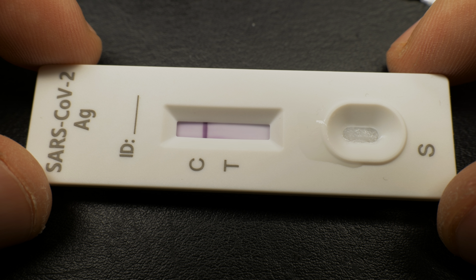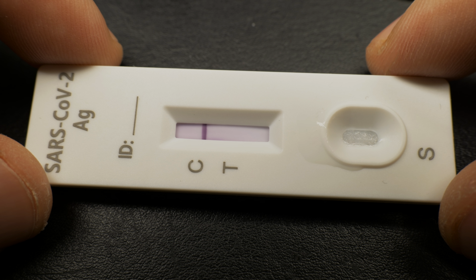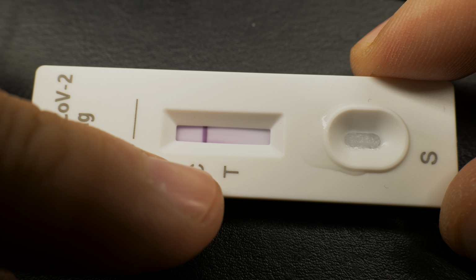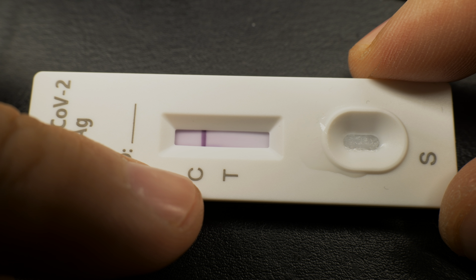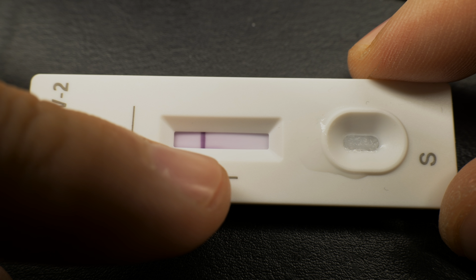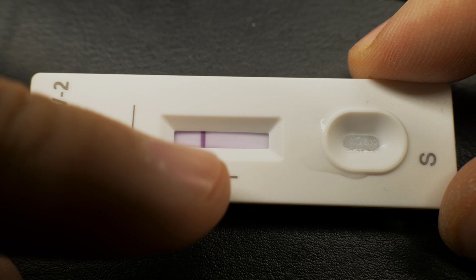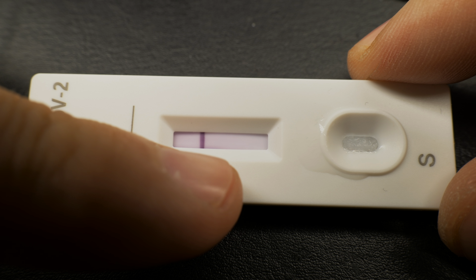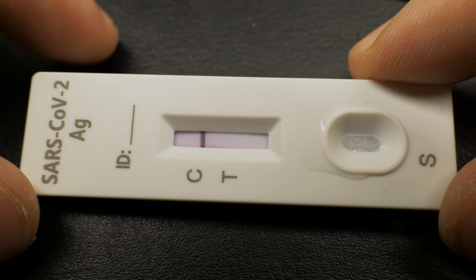And then you have to wait 15 minutes for the test to finish. Once 15 to 20 minutes have passed, for your test it might be different, but for this test it's 15 to 20 minutes, if there is not even the smallest trace of a line on the T here, it's a negative test. If there is just a little bit of a trace of anything here like a line, it's still a positive test.